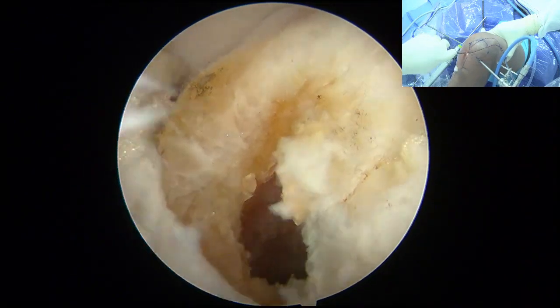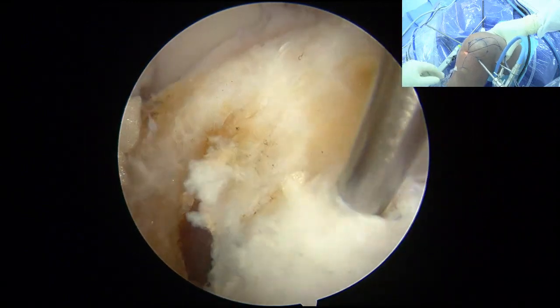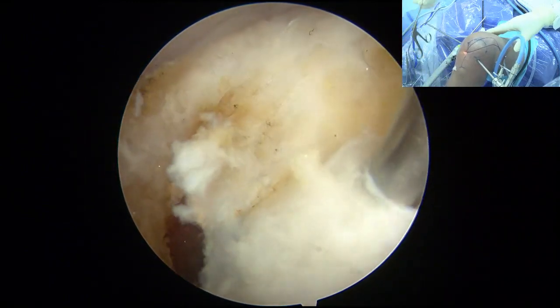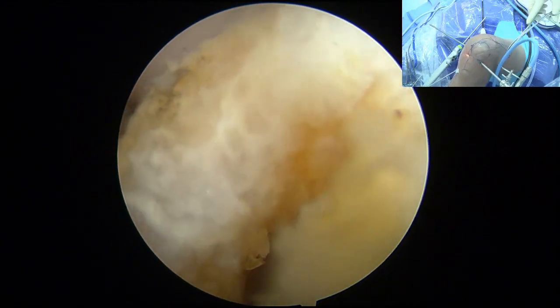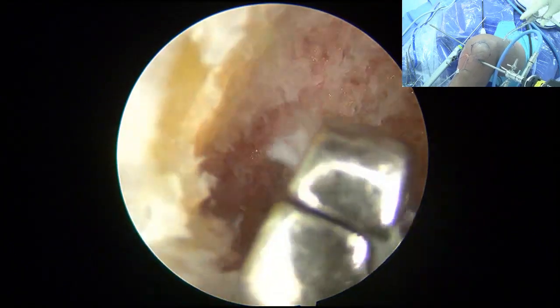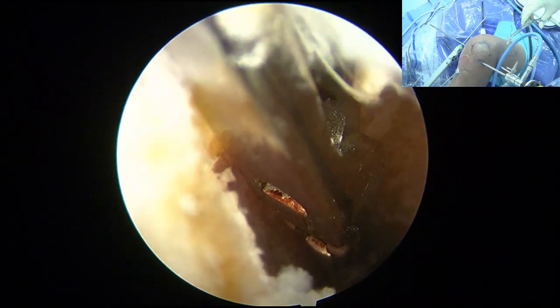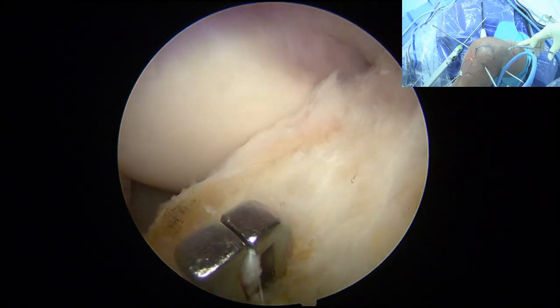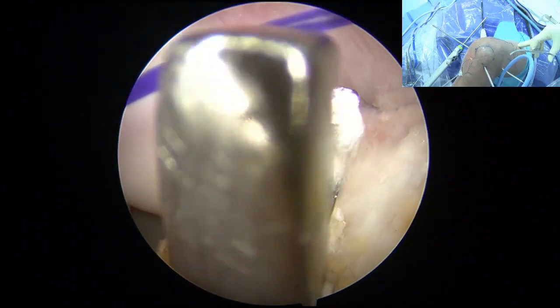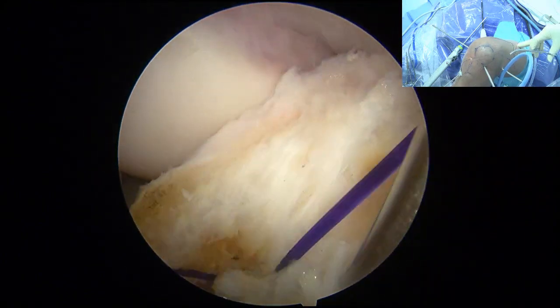It will not move. 我把它扎在软组织里面，就保持一个占据后外侧的这个角色，这个位置。And then here we put this to the anteromedial. Okay, so make sure that your graft will be anteromedial, and the suture will be posterolateral. Okay. So you take that suture.